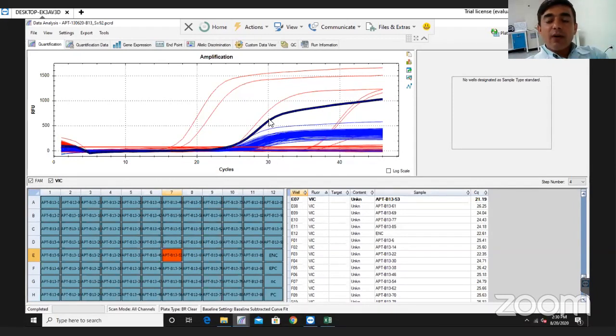Go for a kit that is not a single target kit, but a 2 or 3 target kit. In that case, if there is a mutation in any one of the targets, you will be able to identify the second or third target.